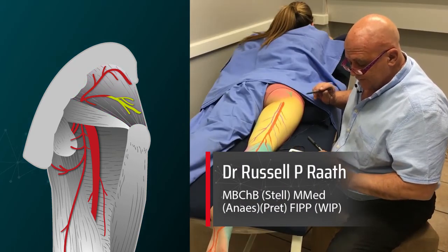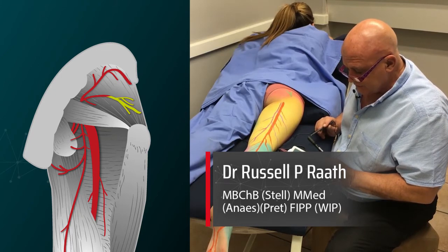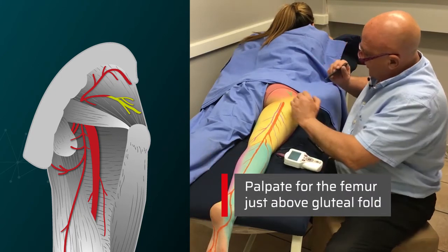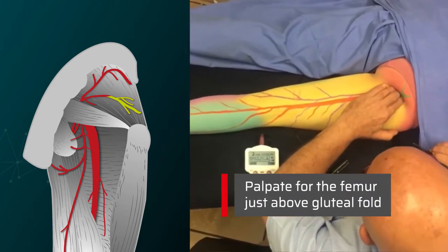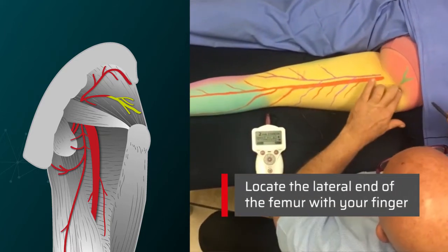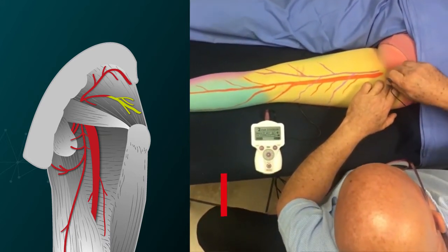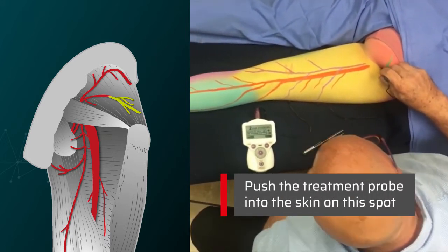We start at a very low milliamperage — we start at 2. We're going to find our spot on the bone; you can feel the bone run from there to there, and on the end of the bone, we'll put our probe in there.